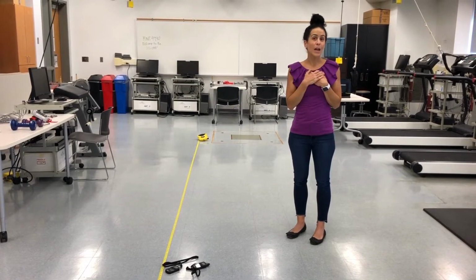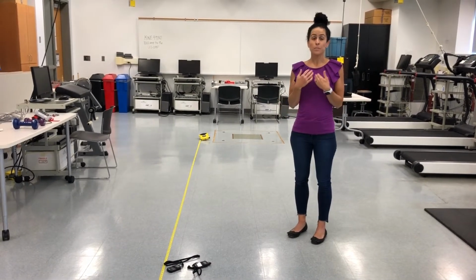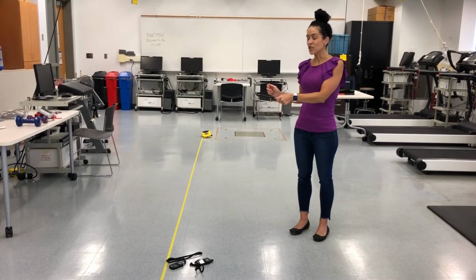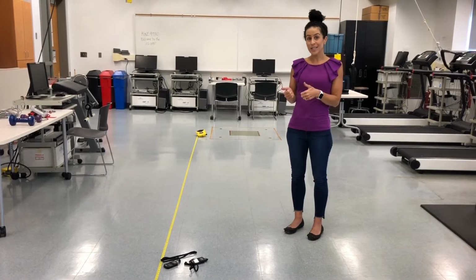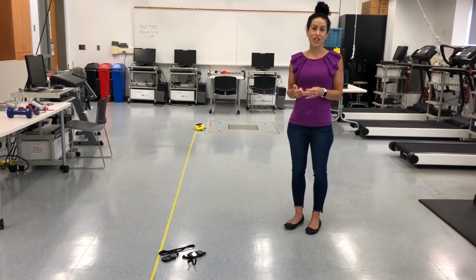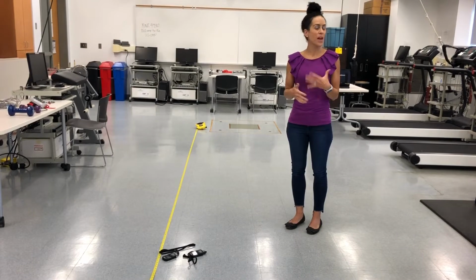However, we're going to show you today what it's going to look like if you would be doing this at home and maybe you only have one other person to help. And so in that case, myself as the investigator is going to have to put some sort of marker. I'll probably just use pens or pencils down each time that Christy's foot hits the ground. And I'm actually going to have Christy holding these stopwatches, and she will feel when her foot hits. And so she's going to have a stopwatch in each hand so that she can help do that timing. And we'll probably do repeated trials on this just to make sure that we have a good rhythm and we have a good system.